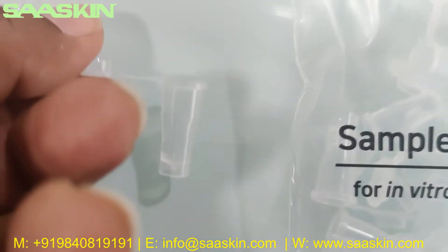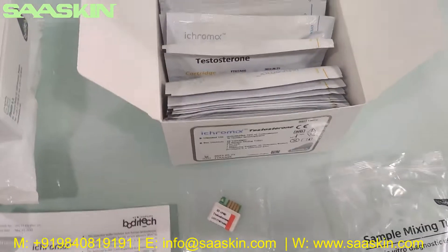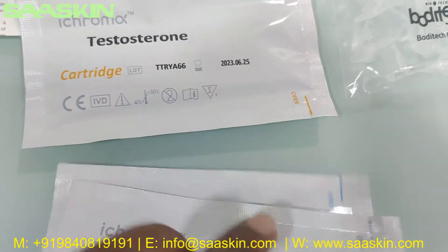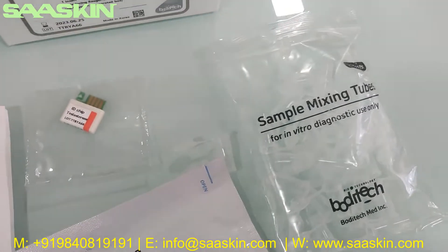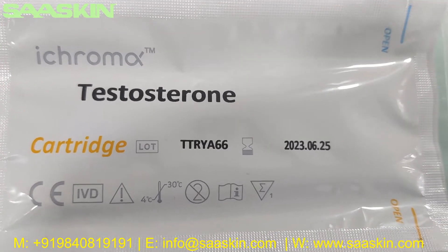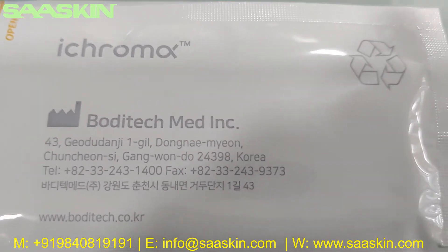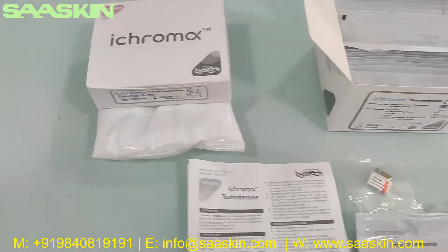There are 25 sample mixing tubes in total, and inside you can also see there are 25 test cartridges. I'm just pulling two cartridges out to show you. This is the i-chroma Testosterone cartridge. You can see the lot number, the expiry date, and it is CE IVD certified. The back side of the cartridge pack contains the manufacturing location and the company — Bodhi Tech, made in cooperation.